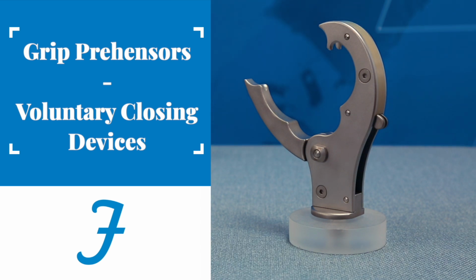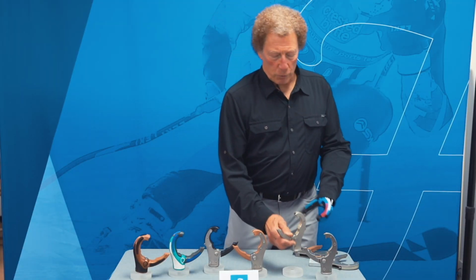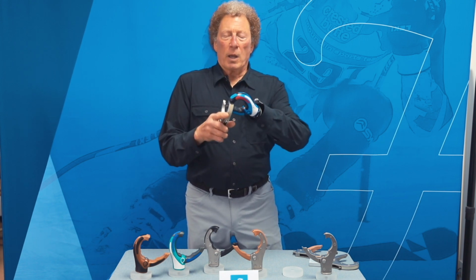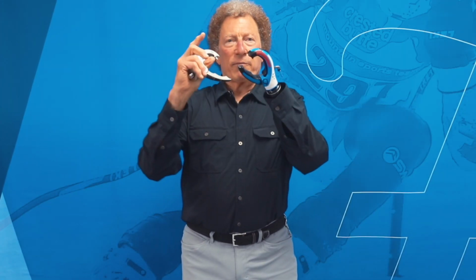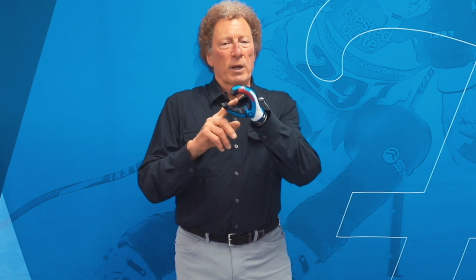And I call them prehensors rather than hooks. A hook is a more overt shape, so our gripping devices, our grip prehensors, have an internal hook, but they're not an overt hook. And the word prehensor means to wrap around. So these devices, when they grasp onto objects, much like the prehensor I'm wearing, have a tendency to grasp and wrap around an object rather than an adduction pinch. So I really like to make sure you understand a difference between a hook, split hook, which has an adduction pinch, and a prehensor, which really has an opposed thumb type of a design.